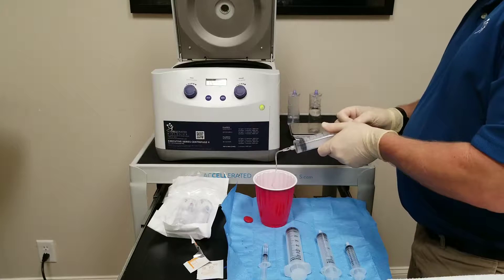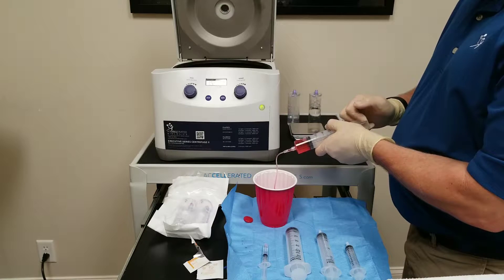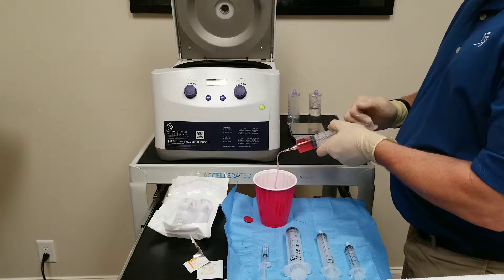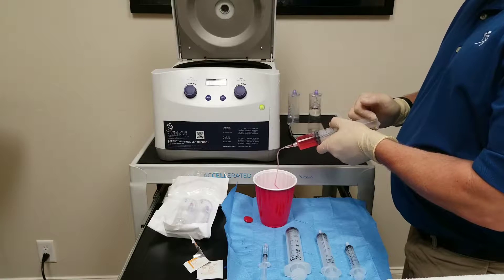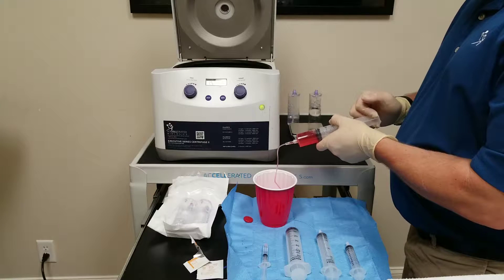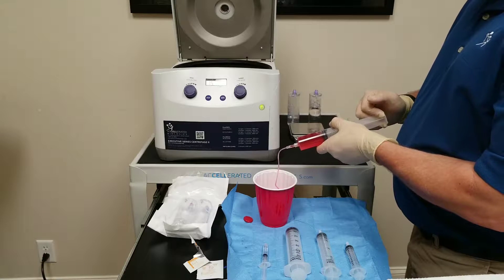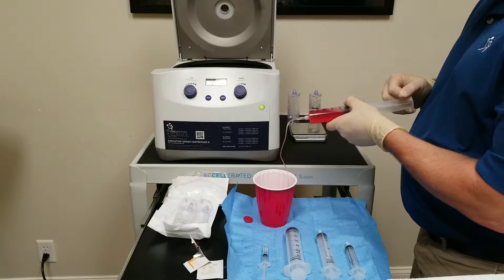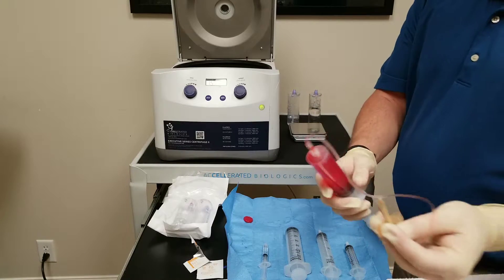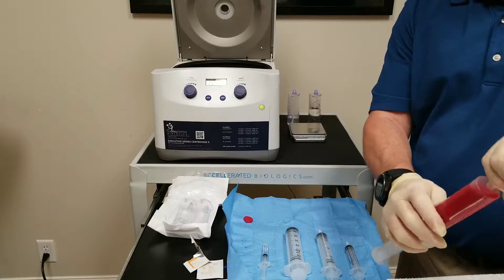Today's patient: red solo cup — always delivers, first stick. The pressure with the 60 ml syringe can be quite severe, so just want to keep a slow and steady pressure. The hardest part of the whole processing is just finding that vein and getting a good stick. The 19 gauge butterfly with this 12 inch tube is the recommended size for ease. This can be done with one person or two people, one holding the butterfly. You can tape down the butterfly if you wish. Once you find a good spot in the vein and know you're in, you can just leave it and pull back all of our blood. Remove the needle, take any remaining blood, leave it in the syringe, take your butterfly and put it into your sharps container.